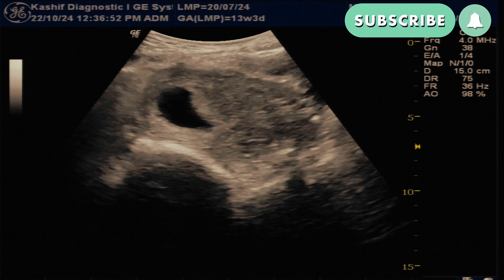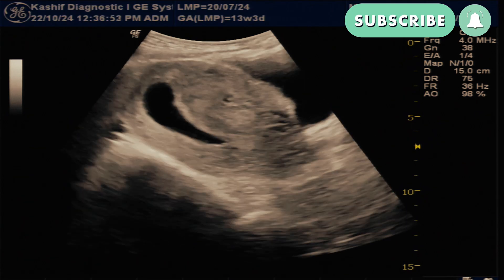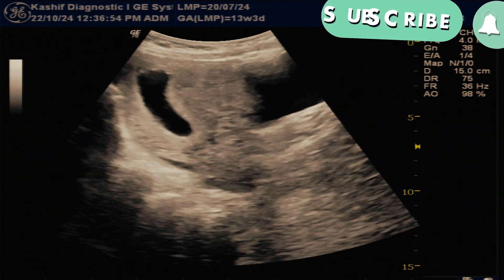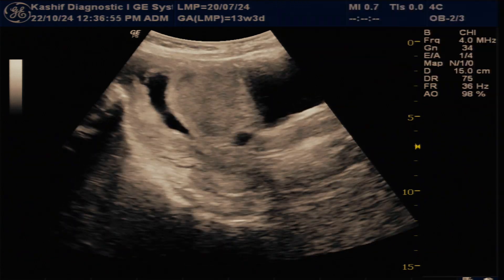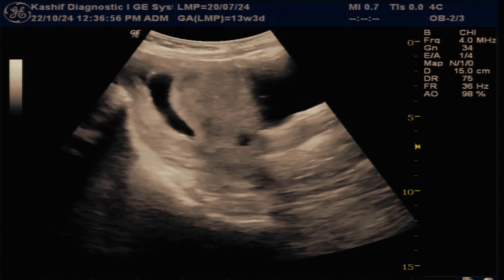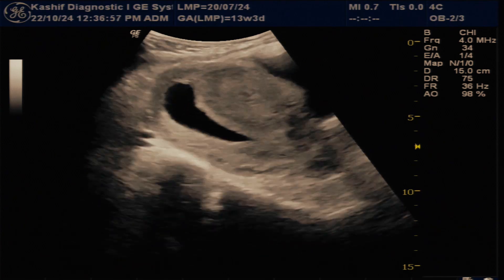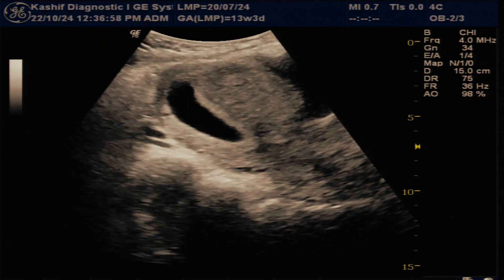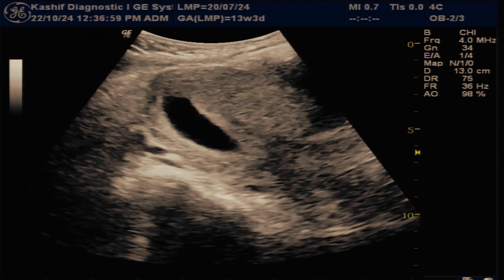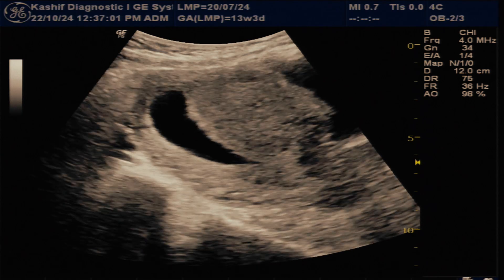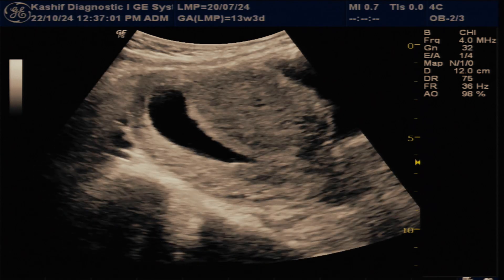This is the abdominal ultrasound. We see a well-defined gestational sac in the uterus. This is normal intrauterine position. There is no free fluid in the peritoneal cavity.